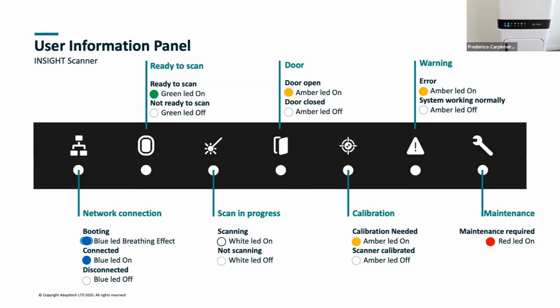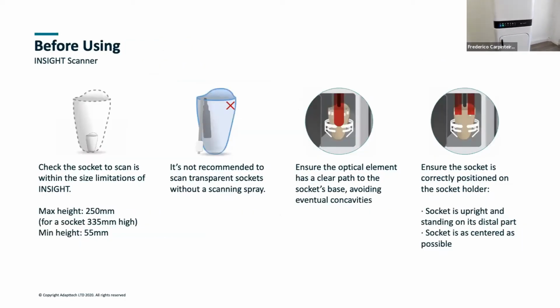Next slide. So just before using the scanner, there are some things that you should look out for. Make sure that the socket is within the size limitations of the system.